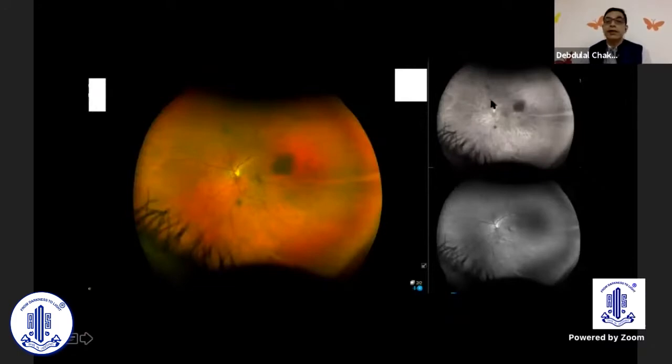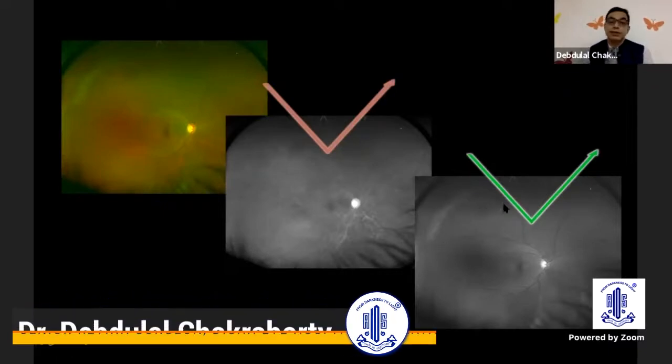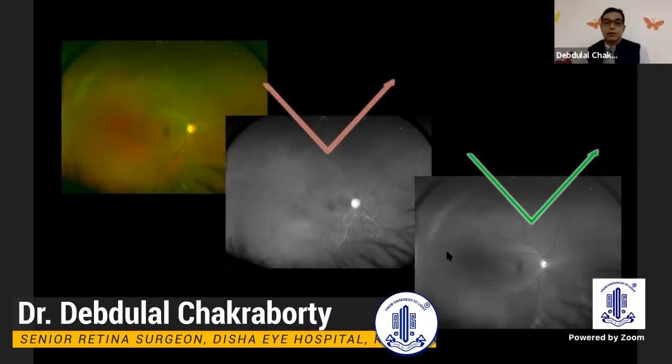So the red laser captures the choroid basically. So you can see the nevus clearly, and with the green laser, it is missing here. So therein lies the utility of the green laser and the red laser. And going back to our simple lattice here, you can see the red laser has not really picked it up, whereas the green laser has picked it up. So you can actually utilize these to locate or find out your area of interest.